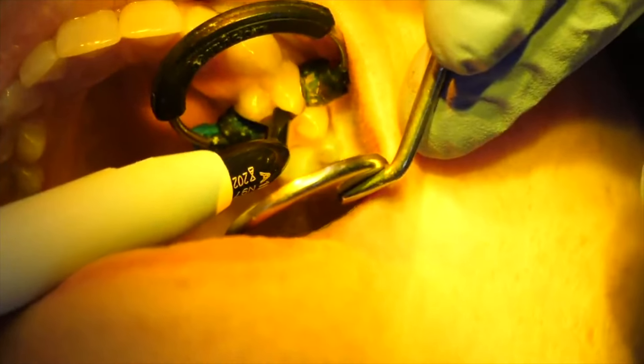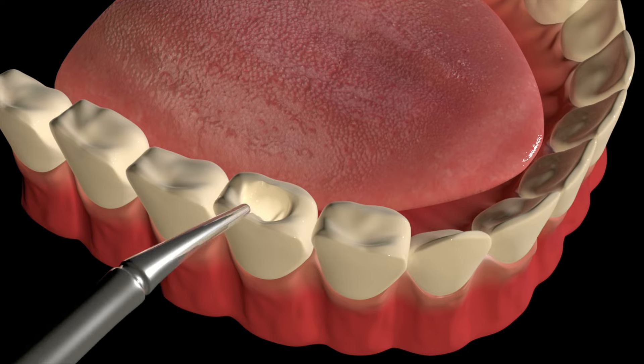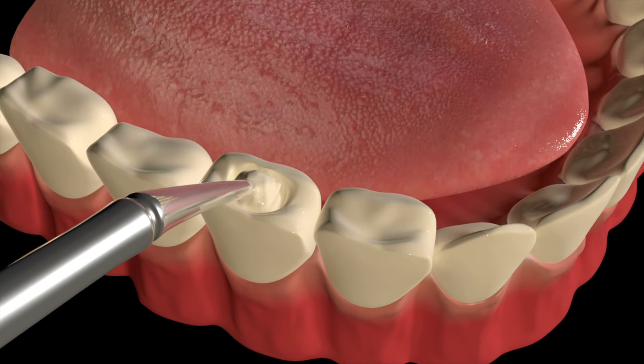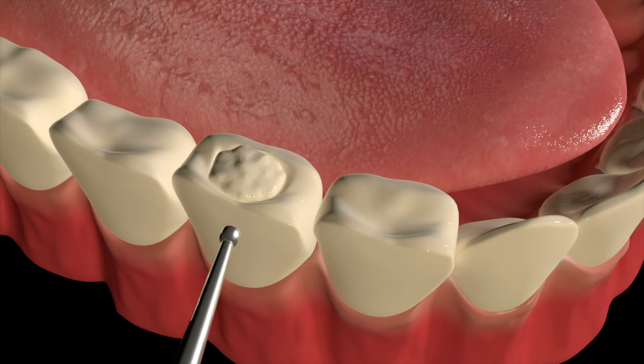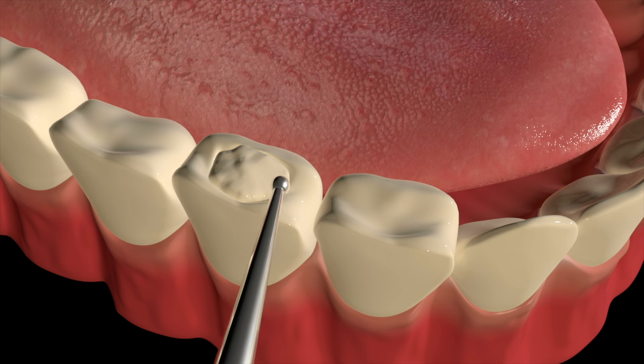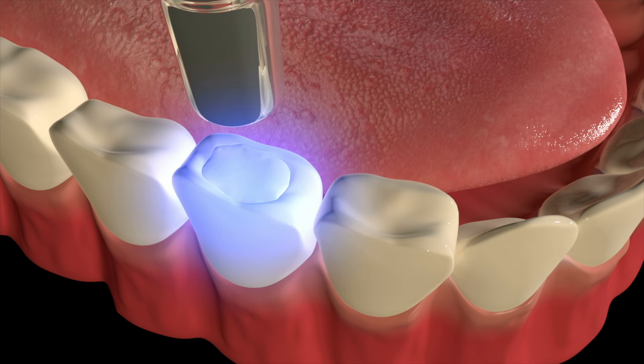Finally, they will place the filling material on the tooth and use different instruments to pack it and make it look like a tooth. Dentists will spend some time making it look good — they want to mold the filling material to match the shape of your tooth. Once the dentist is happy with the shape, they will light cure it to harden it, so now it's a permanent filling in your mouth.